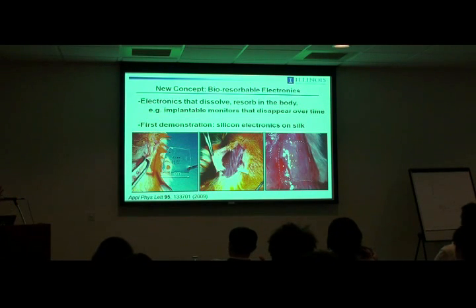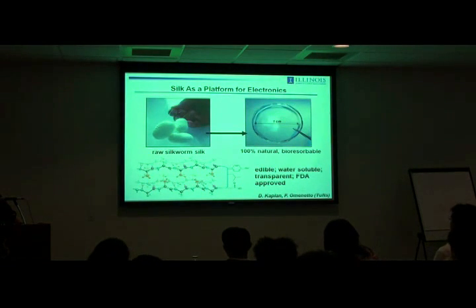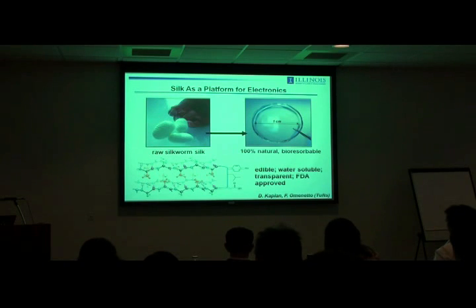So the idea is you could perhaps design this system, it's not fully bioresorbable, to eliminate any kind of adverse reaction by choosing the mass loading, the total amount of non-resorbable material, to be as small as possible. So that's a concept. I'll describe in a second how that relates to this neural monitoring application. But the silk itself starts from raw silkworm cocoons. There are ways to purify this material and cast thin films of it that are robust platforms for the kinds of electronics I've talked about up to this point.